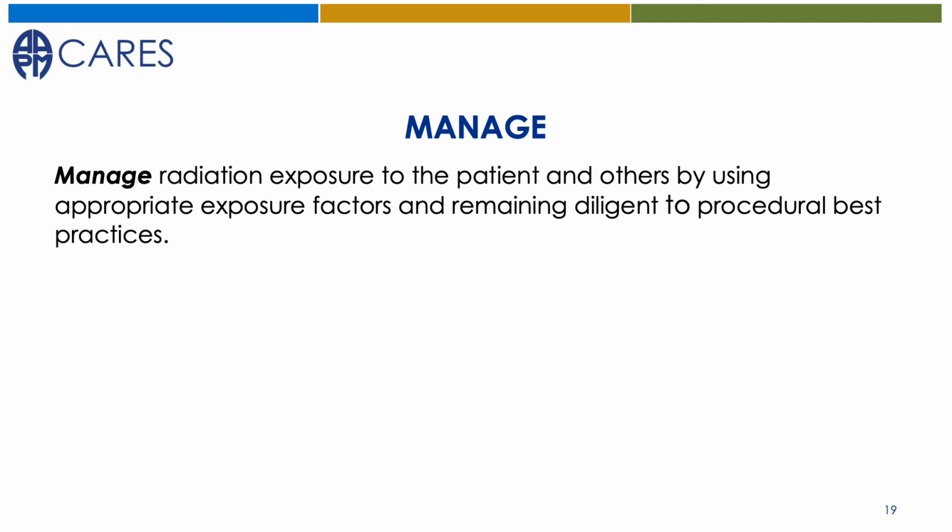M is for manage. Manage radiation exposure to the patient and others by using appropriate exposure factors and remaining diligent to procedural best practices.